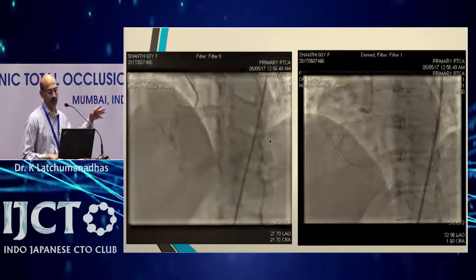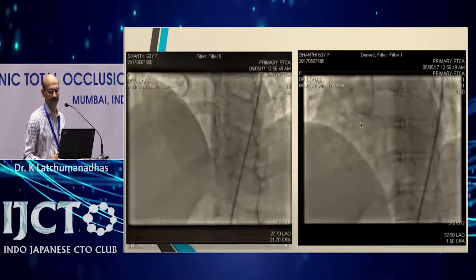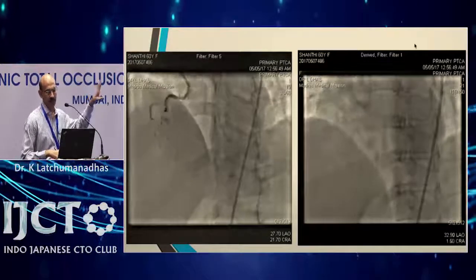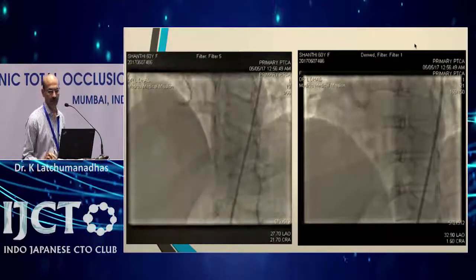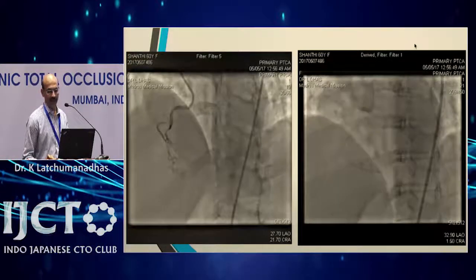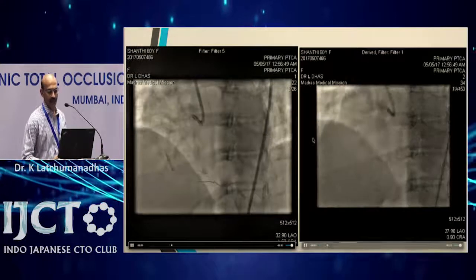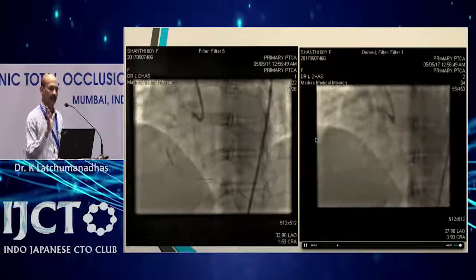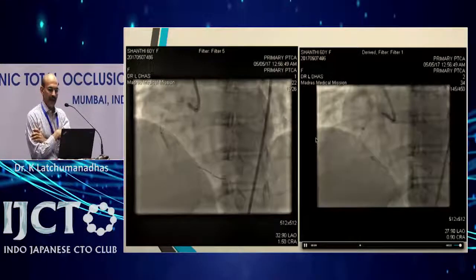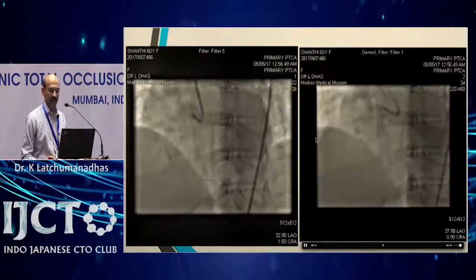This is a total occlusion in the mid and distal portion of the RCA, and then it is wired, a very tortuous course, and then you can see the calcium throughout from the proximal to distal. The wire we were able to pass, then we sequentially dilated, and you can see that now what I have done is I have used the balloon for anchoring distally, and I have used that GuideLiner also.